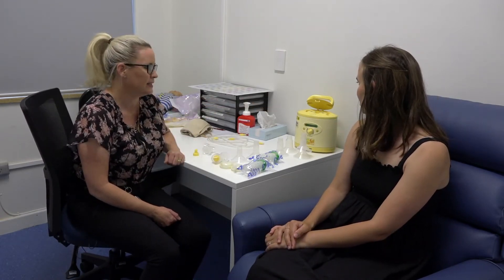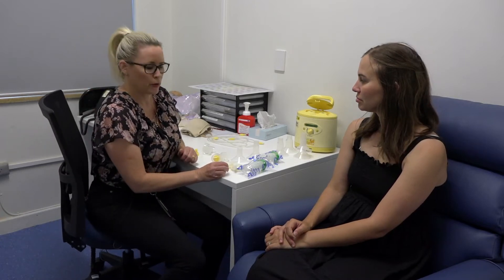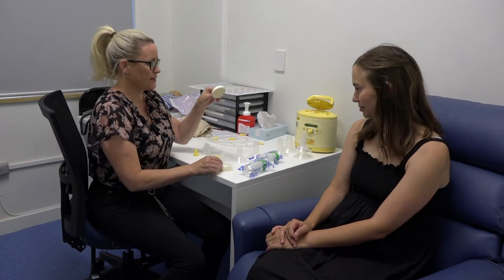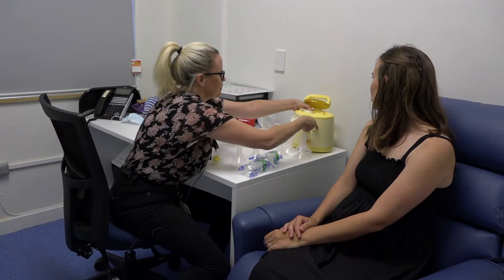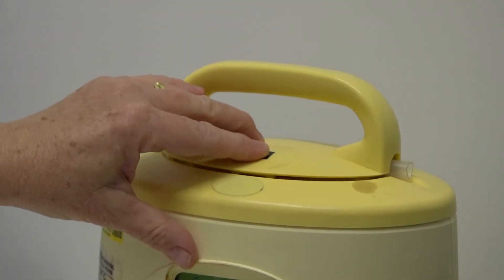Today we're going to be using the Symphony pump, which is this yellow pump that you can see here. This particular pump has a program called the maintain program, so that's what we're going to use today. We need a little bit of equipment: we have some caps and membranes which fit into the top of the pump here — they just snap in there — and then we just close the lid.